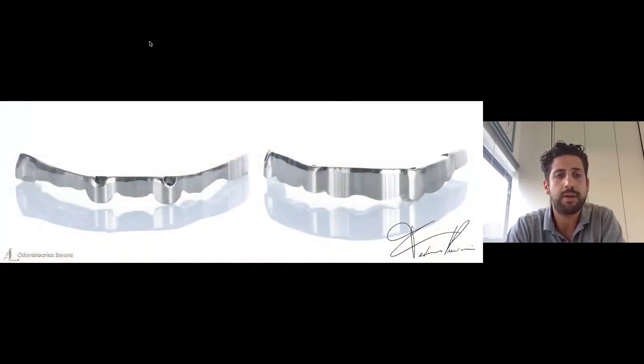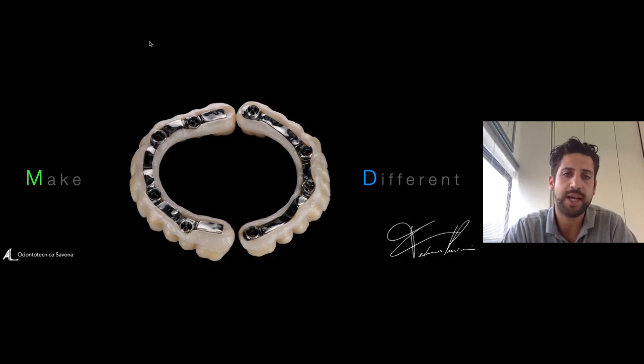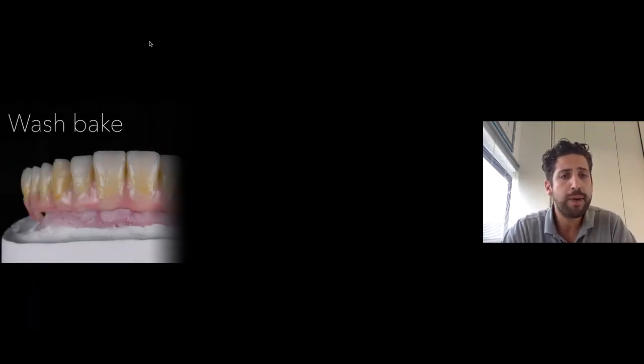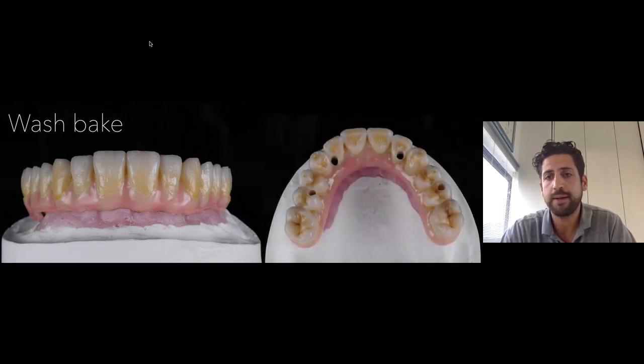Okay, those are our two bars. And we go to make the fitting. Okay, when everything is really passive and we don't have any kind of tension between titanium and zirconia, we are ready to start our build-up of ceramic. So, wash bake, at the same time we applied some stain for the teeth, and we applied the gingiva ceramic for the wash bake.